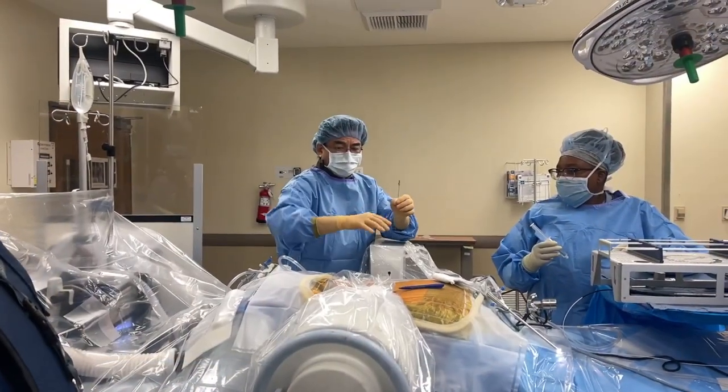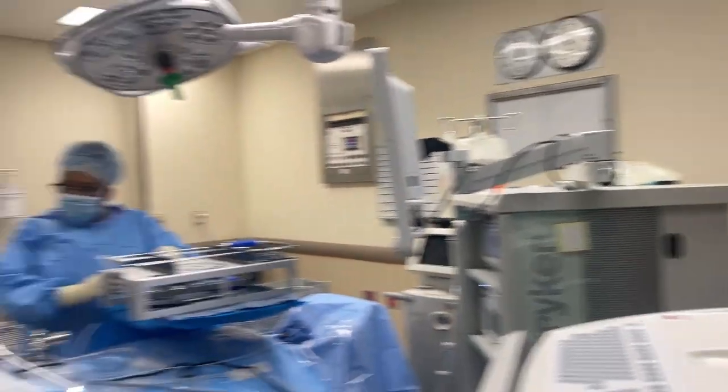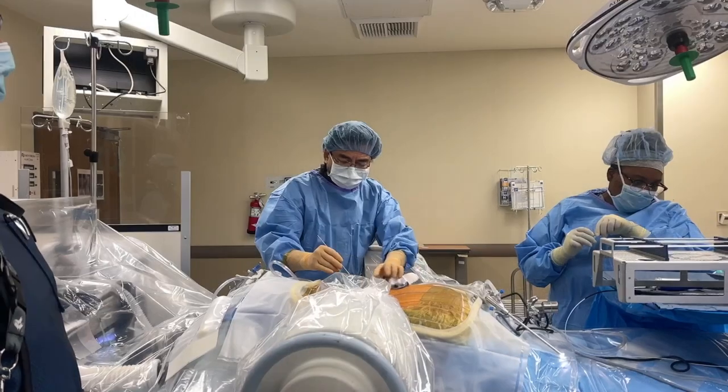All right, we're getting started. I have the perfect x-ray at that level. Now I'm gonna use the spinal needle to confirm the perfect entry point. It's my little secret, don't tell anybody. All right, Amy, the perfect little poke hole.